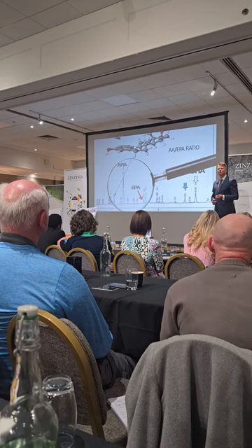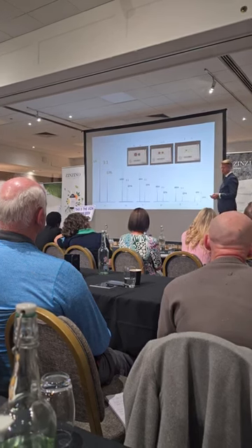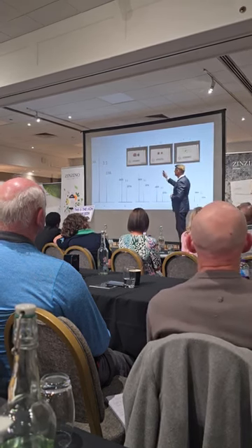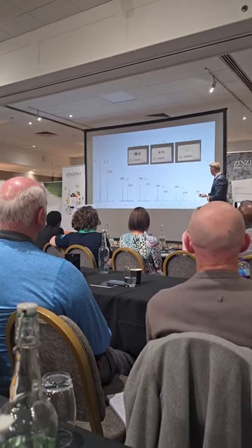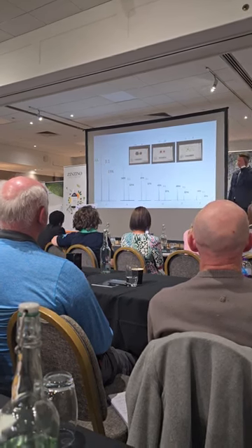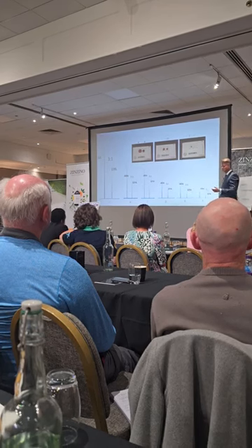And this is so important for the Encino test, because when you do home sampling of blood samples, it can look like this. Sometimes you get a lot of blood, and sometimes very little blood. So if you use A and B samples with a lot of blood, you will have high peaks, right? Because there's a lot of blood. And if you use this sample with very little blood, you have really small peaks. But look at the ratio. It's always the same. Because these peaks go up and down in the same manner. High peaks with a lot of blood, small peaks with little blood, with always 3 to 1, or another ratio.